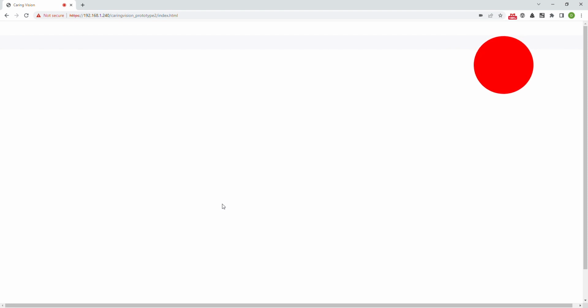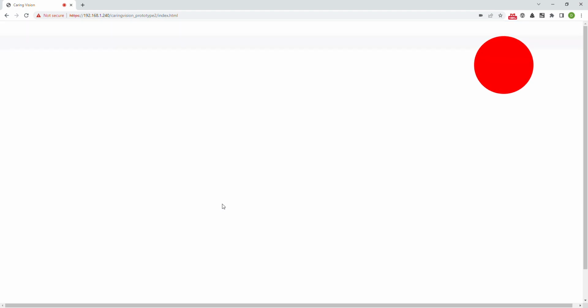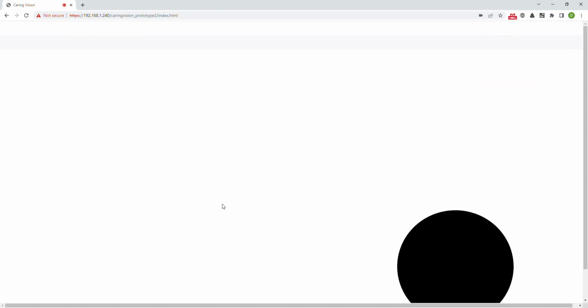and pauses the test as well. So for example, if I look away now, it will come up with a message saying that I'm looking away, and then I look back at the screen again, and the test will continue. As I look at the red dot there, because of course I've just confused it, now it's looking at all the different areas and making sure that they're all calibrated.